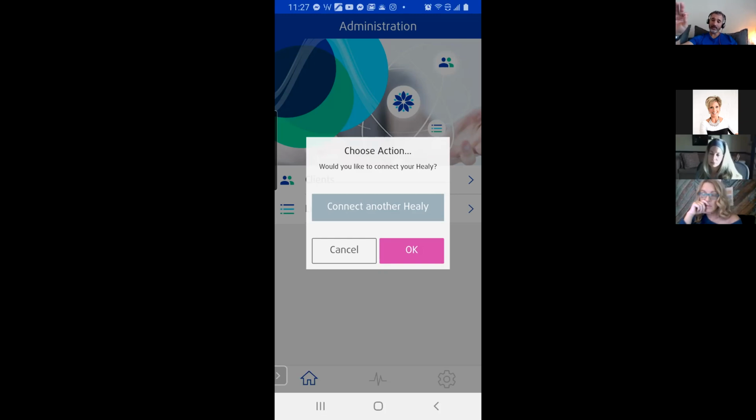You need to go into your settings on your phone and change it so that your phone doesn't turn off all the time. Now, that's one reason why I like to use a pad, because if I'm running scans or vibrational programs on my phone, I can't really do anything else with it, okay? And I'm not so good at sitting around for 5 minutes doing nothing, so sometimes I multitask, and I'll run programs from this pad. Now, this pad is a Samsung tablet. I bought it at Costco for like 140 bucks. Works great. I don't need a data plan with it. It just needs to connect to Wi-Fi, that's all.